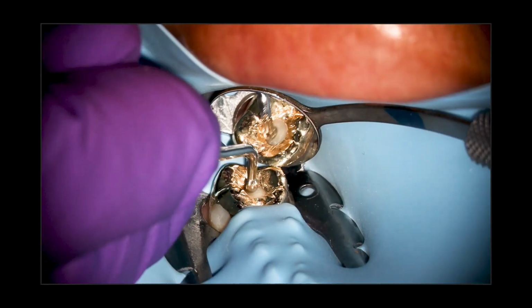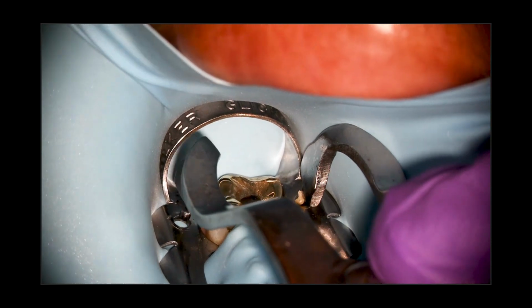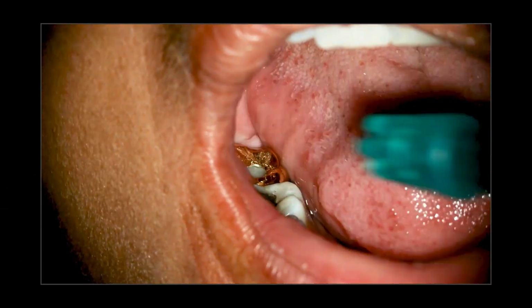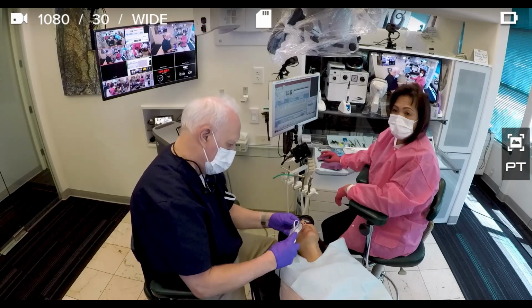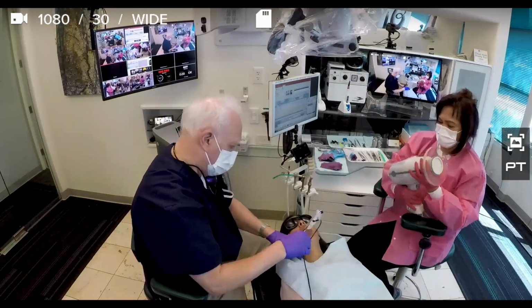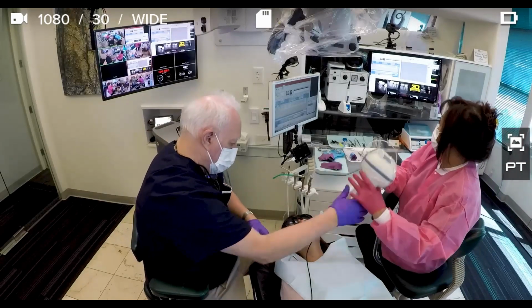So let's take it from the moment you complete a case. Here we are putting the final restoration in a case we've just completed. We take the dam off. And now we have to go about generating the report, all the things necessary to do. So the first thing to do is you need to take a final radiograph because that needs to go into the final report. So you ergonomically take the final radiograph.